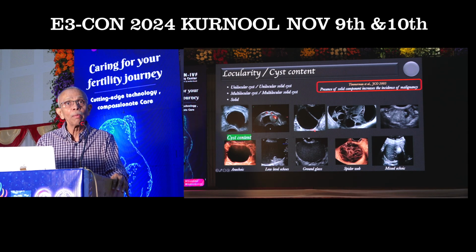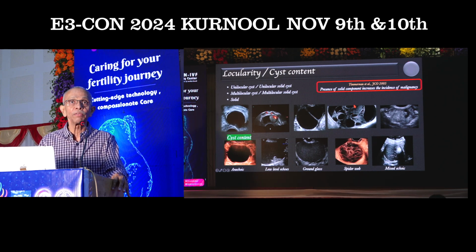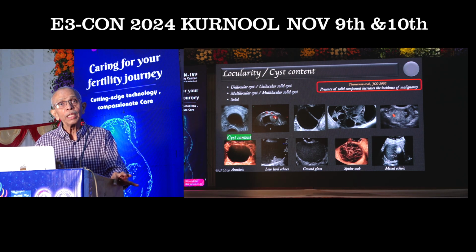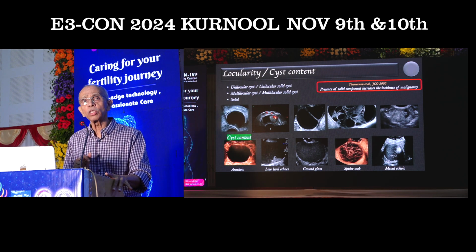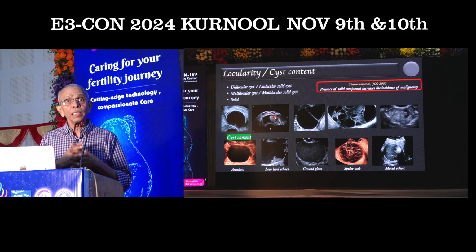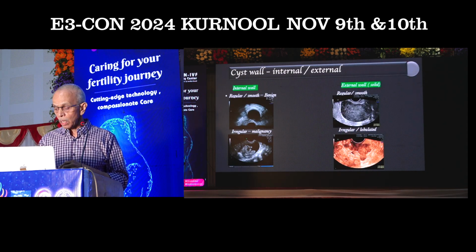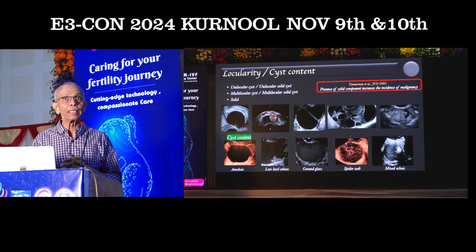That is, you have a multilocular cyst where there is no solid component, or you may have a multilocular cyst with the presence of solid component, or the lesion can be absolutely solid. Now, why are we worried about the solid component? Because the presence of solid component definitely increases the incidence of malignancy. That is the reason why we need to be very cautious.